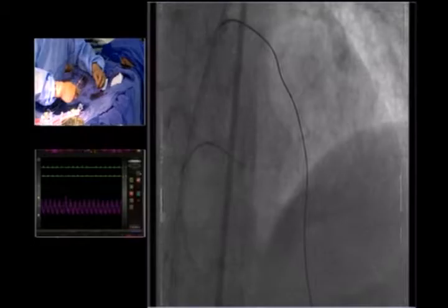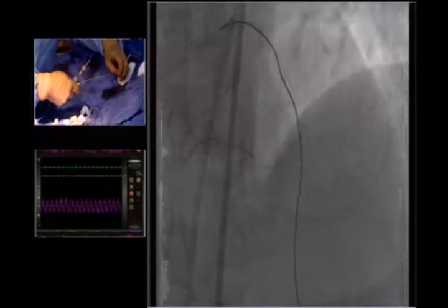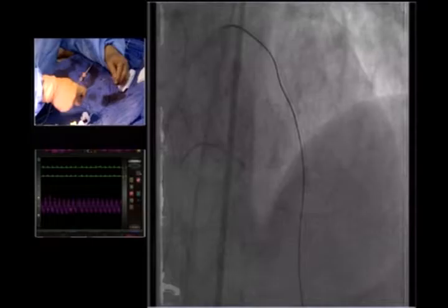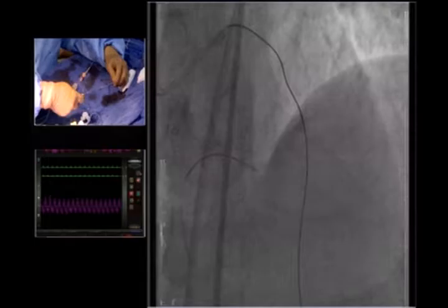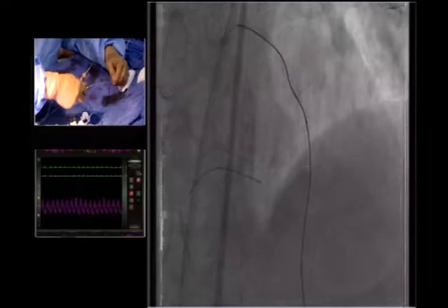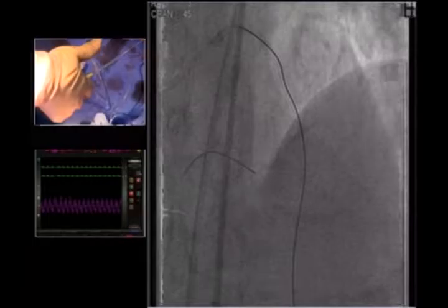Very rigid vessel. Very rigid. It's moving. Yeah, a little bit advancing, you know. Making small progress. Okay, and a little bit progress. And after 15 turns or so, you have to reset, unwind, and then proceed. Yes. You're almost through. No, it's still far down. You think so? I'm not so optimistic.